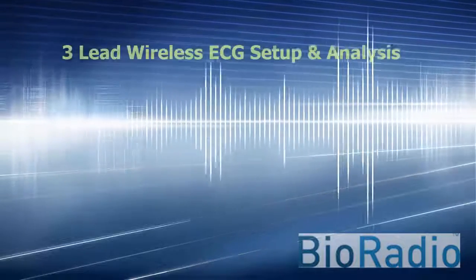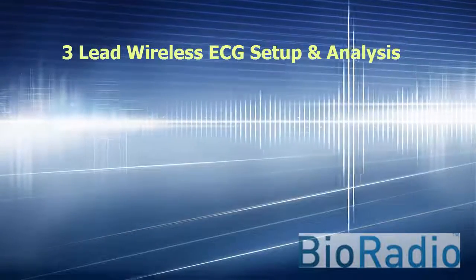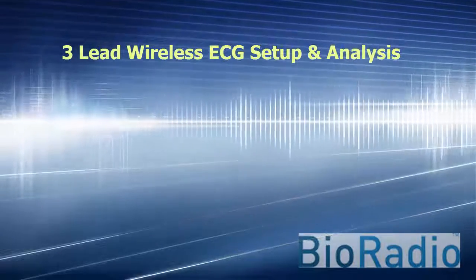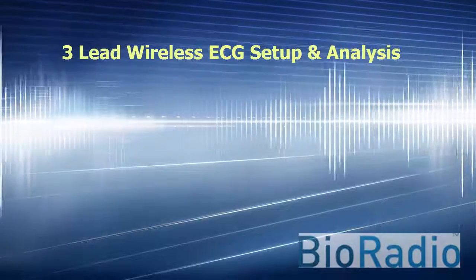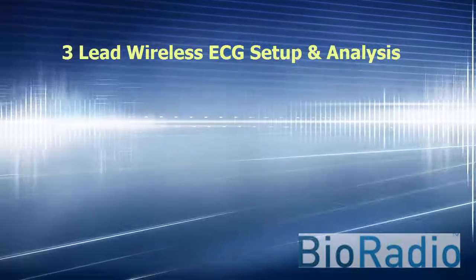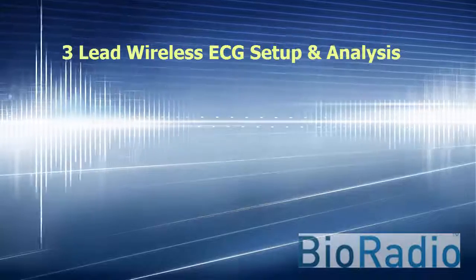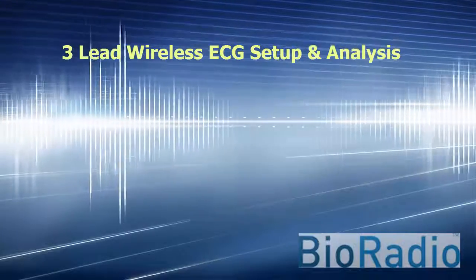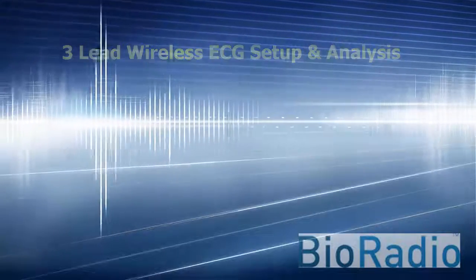Welcome to the 3Lead ECG setup and analysis video. For this video, we will be showing you how to use the BioRadio for a 3Lead ECG acquisition and how to use our BioCapture software for data acquisition.